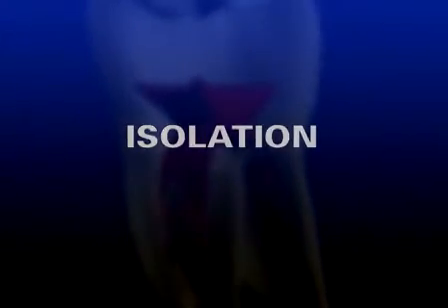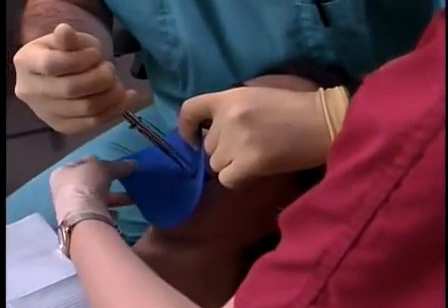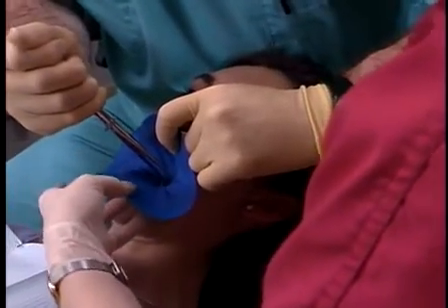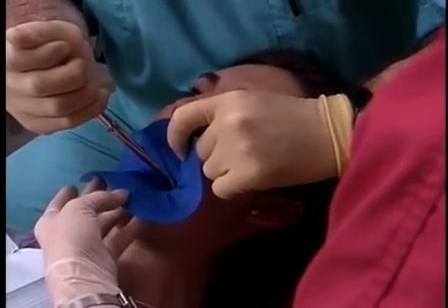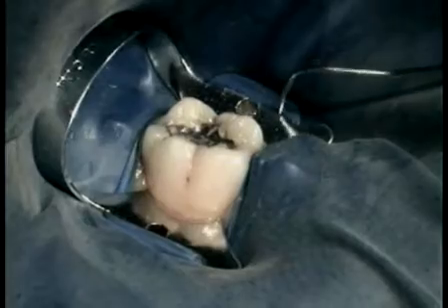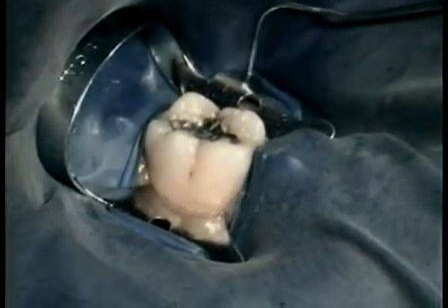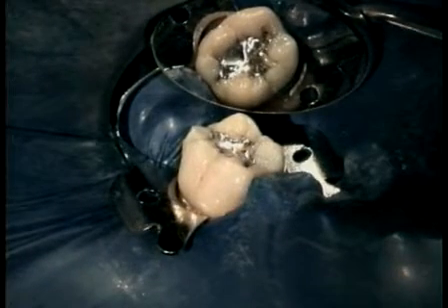Isolation is essential in endodontic treatment. Isolation accomplishes soft tissue retraction, protects the oral pharynx, and prevents salivary leakage. Isolation can be accomplished in a one-step procedure. The forceps carefully guide the clamp over the tooth, and the jaws of the clamp are released so that they don't impinge on soft tissue. A 17 Explorer can be used to remove the rubber dam off the tines of the clamp. Dental floss is important to use to get the rubber dam down between the contact points. Oraseal can be further used to isolate the tooth during treatment.